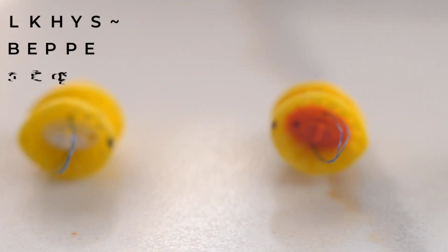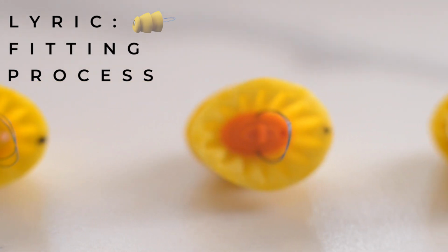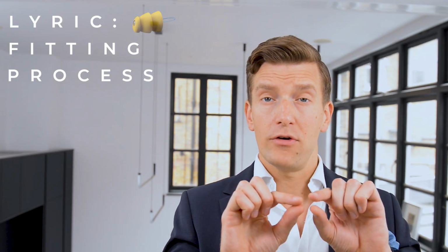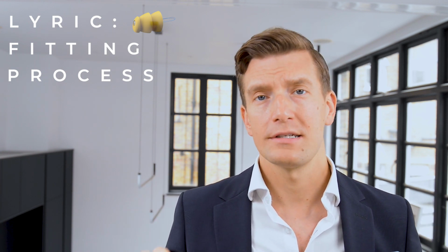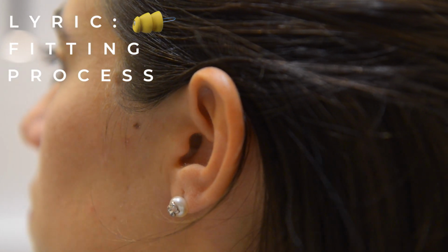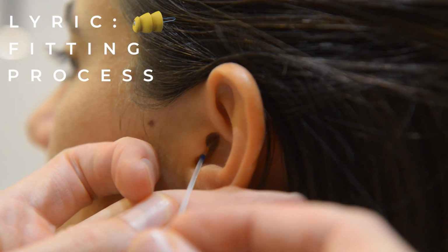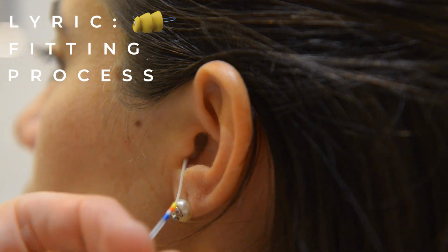The Lyric itself comes in 7 different sizes, and before we can fit it, there are 2 measurements that we need to take in order to get the most appropriate fitting for the person sat in front of us. So number 1, we need to look at the correct insertion depth, so that's how far down the ear canal it needs to fit. And number 2, we need to look at which is the most appropriate size Lyric for the individual that we've got. The process involved in measuring the correct insertion depth of the ear canal involves using a specially made silicone thread, which we gently thread down the ear canal until it taps on the eardrum. That gives us a measurement in terms of how far down we should put the Lyric.